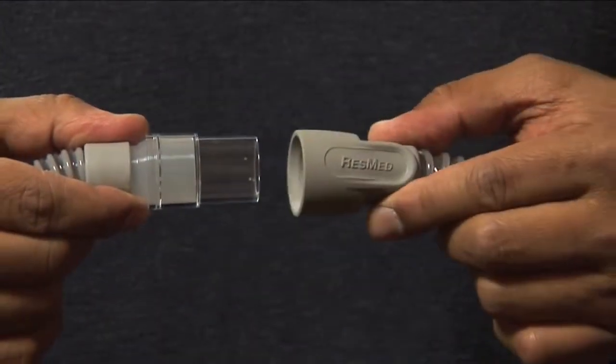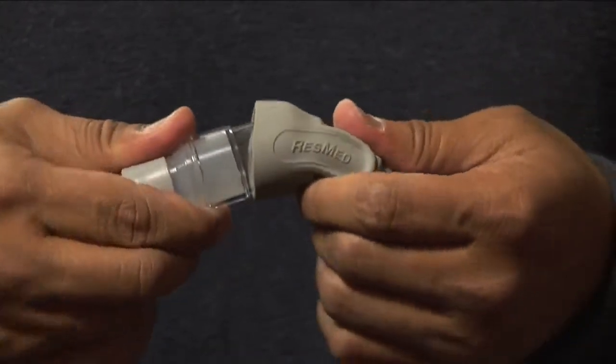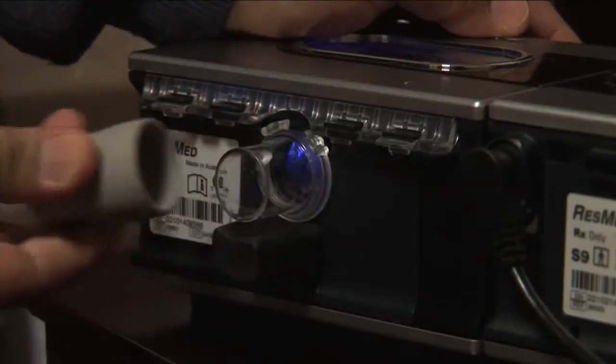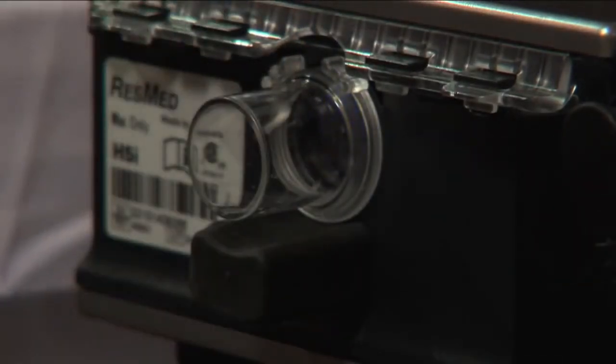The hoses for these devices are fitted with a rubber coupling on each end. When removing a hose, be sure to handle it using the coupling. You should also avoid yanking directly on the tubing. If you have difficulty removing a hose, use your thumb to peel back the edge of the rubber coupling so the hose will slip off more easily.